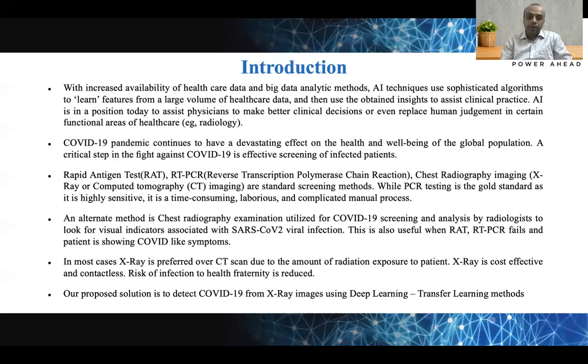Today's main focus is detection of COVID-19 in X-rays. As we all know, the COVID-19 pandemic has had a devastating effect since 2020, and screening for COVID-19 quickly among the population becomes a very important subject. As you all know, we have very well-known tests like rapid antigen tests and RT-PCR tests, which are very widely used for COVID-19 detection.